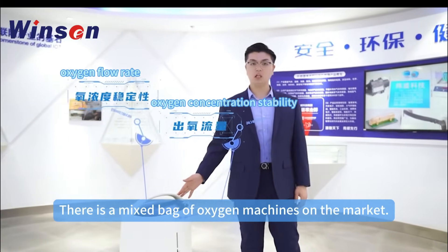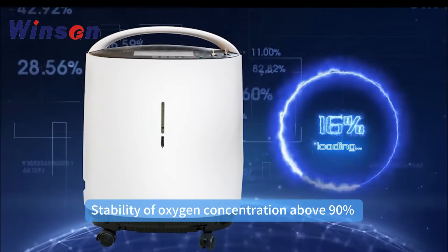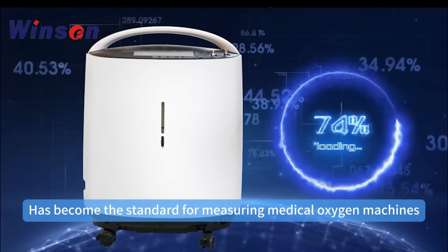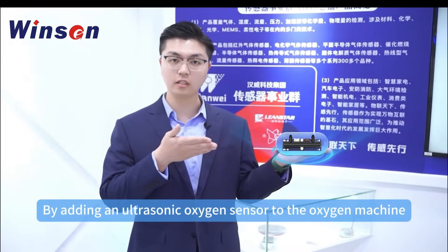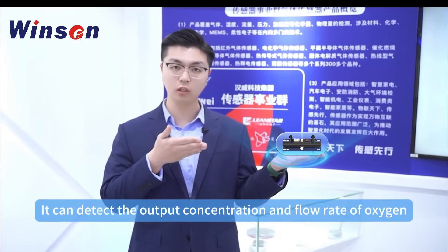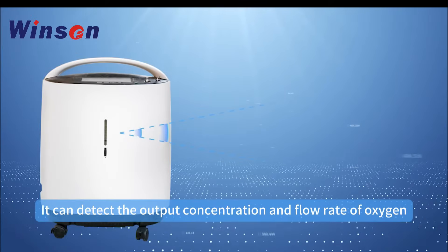There is a mixed bag of oxygen machines on the market. Stability of oxygen concentration above 90% has become the standard for measuring medical oxygen machines. By adding an ultrasonic oxygen sensor to the oxygen machine, it can detect the output concentration and flow rate of oxygen.